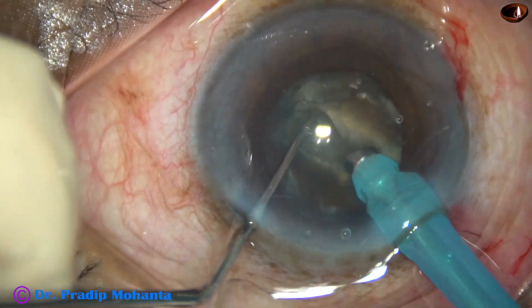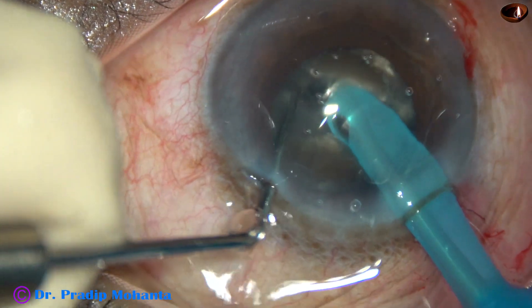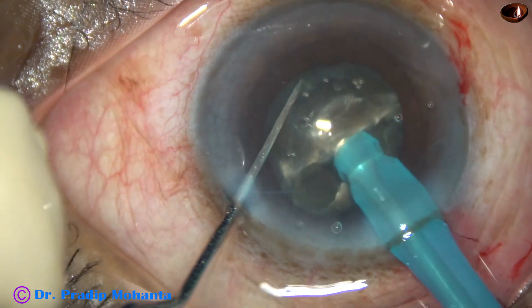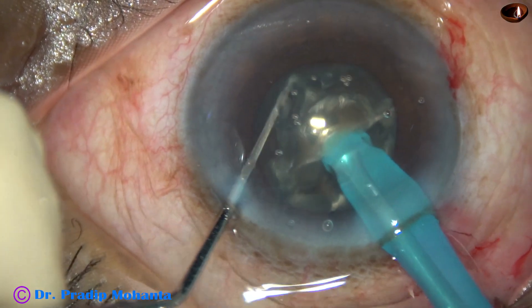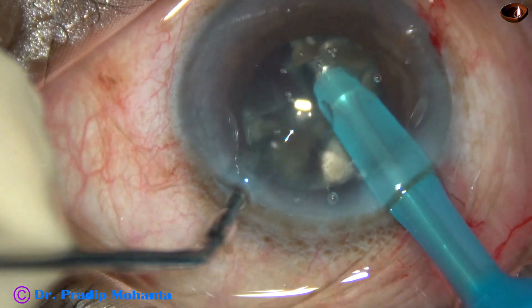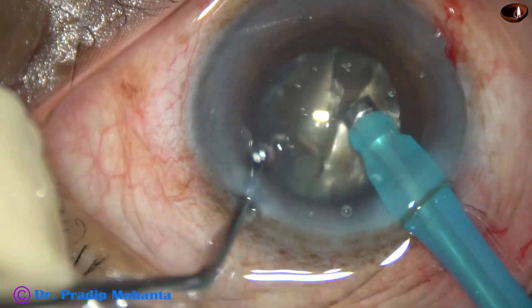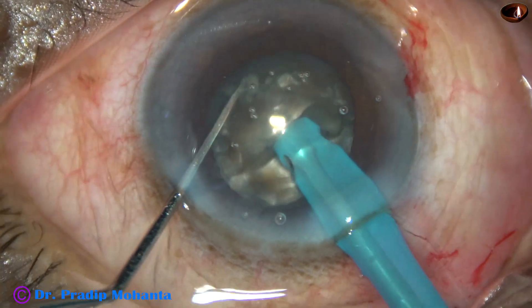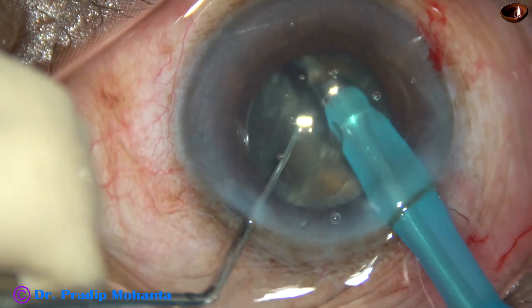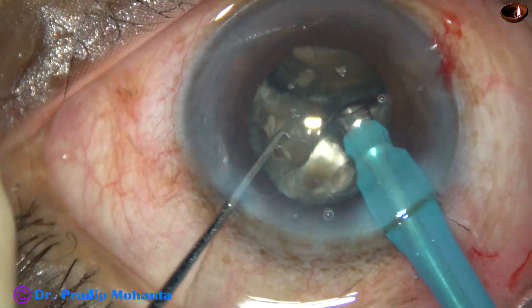The nucleus is rotated 180 degrees. The handpiece is used to hold one hemi-nucleus, and the other one is separated by the chopper. This is one hemi-nucleus — it is also chopped into two large fragments. The nucleus is rotated and we come to the other hemi-nucleus. This hemi-nucleus is also chopped into two large fragments.